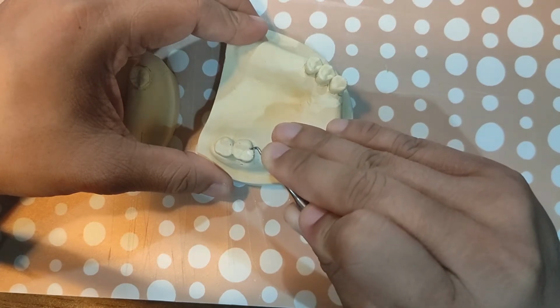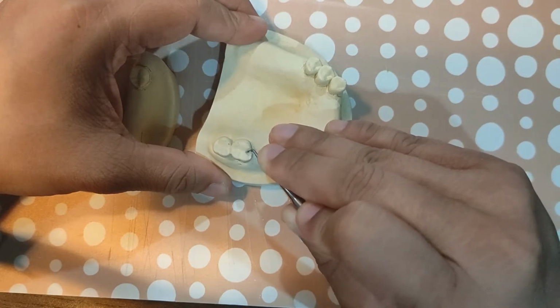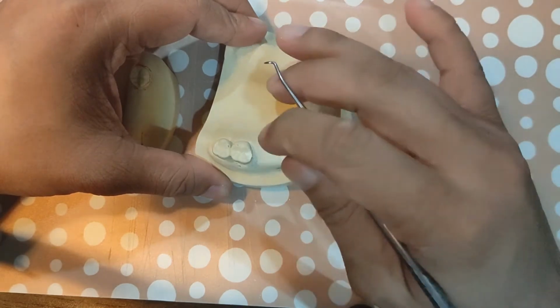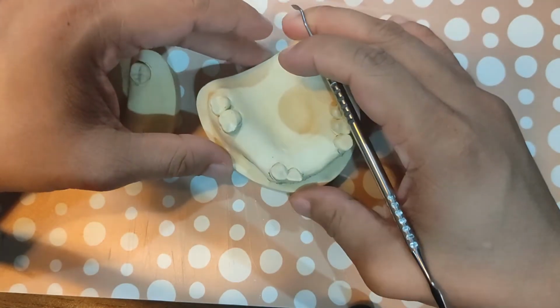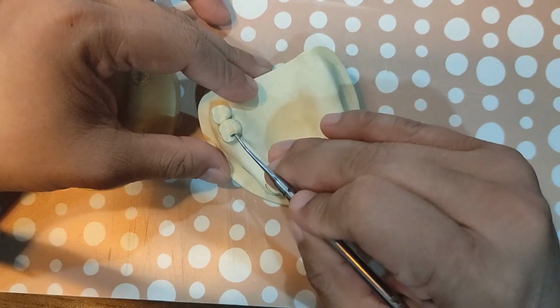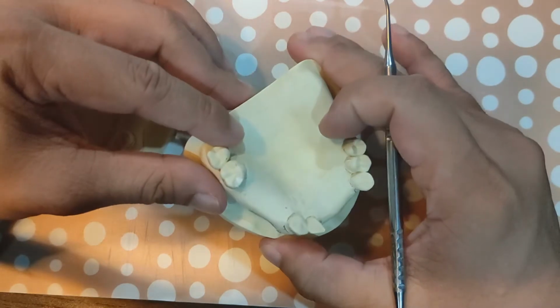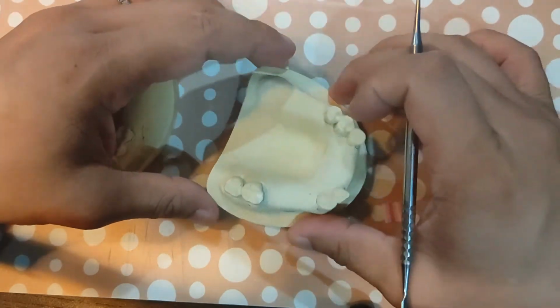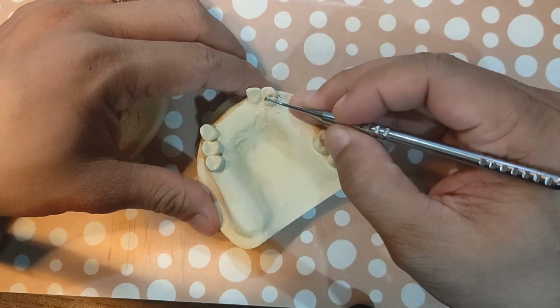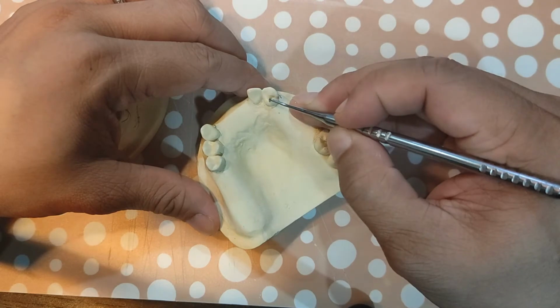Alright. Dimensions should be around 1 to 1.5 millimeters deep so that you do not excessively expose the dentine. Okay. And again, on the cingulum rests, a cingulum rest is V-shaped around the cingulum.